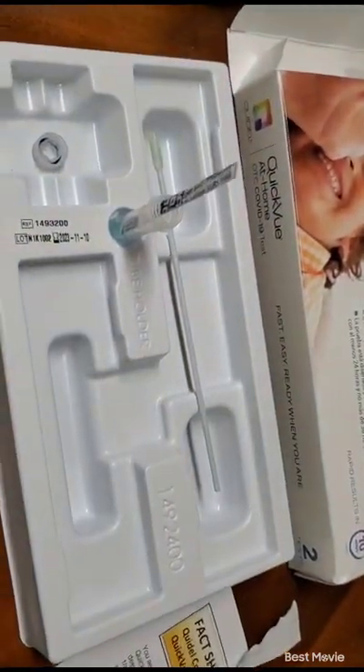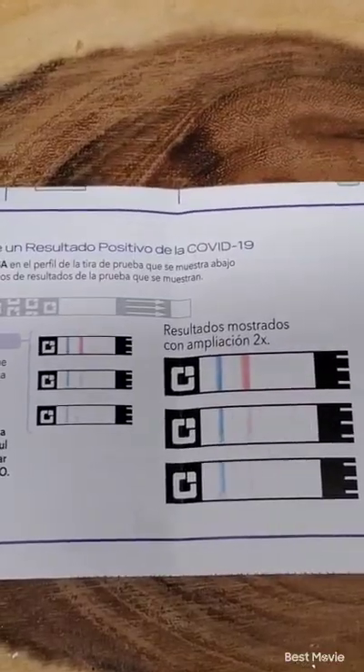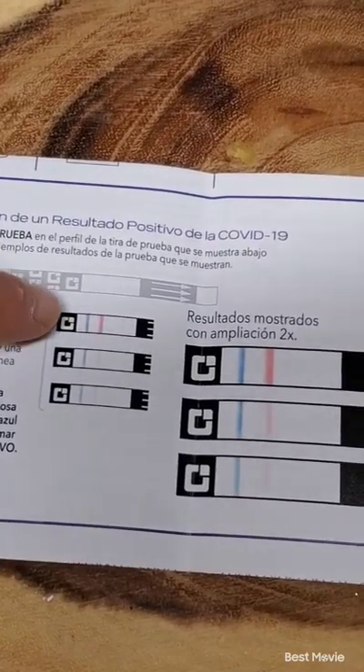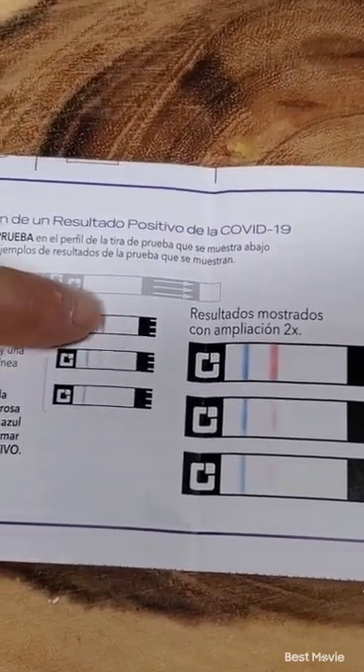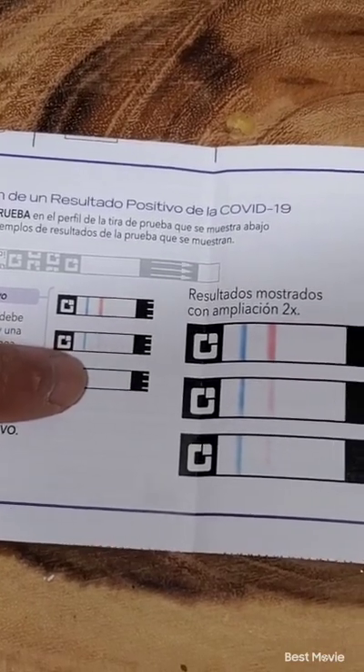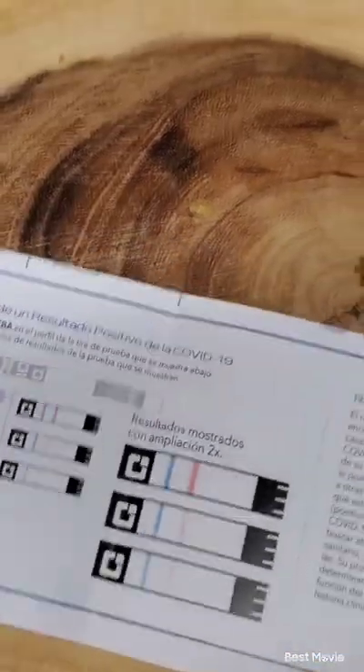Alexa, set an alarm for 10 minutes. So this is just a demonstration of what a positive test would look like — it has the blue line and it has a pink line. Even if you have a faint pink line like shown here, that means you're still positive.